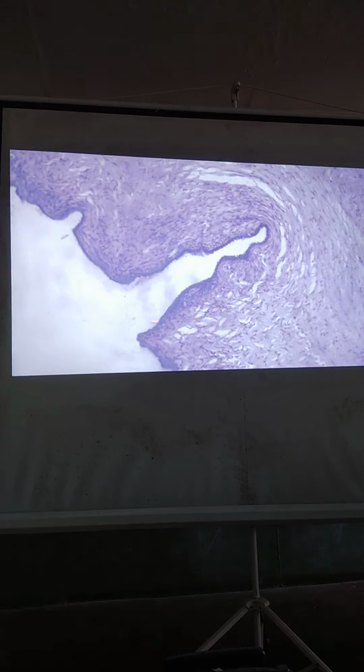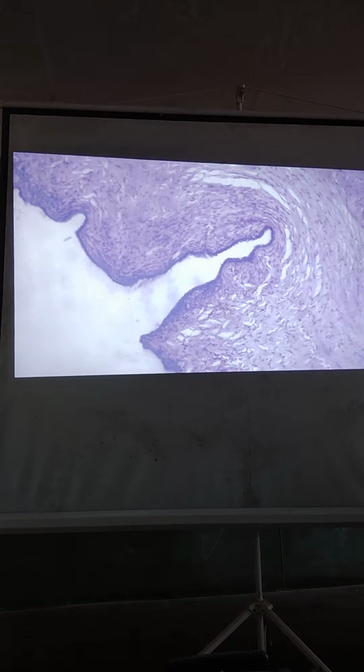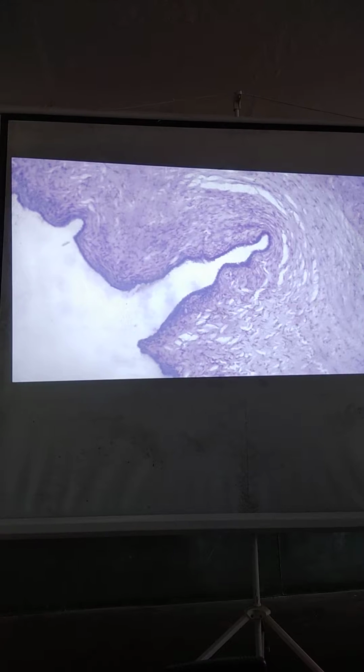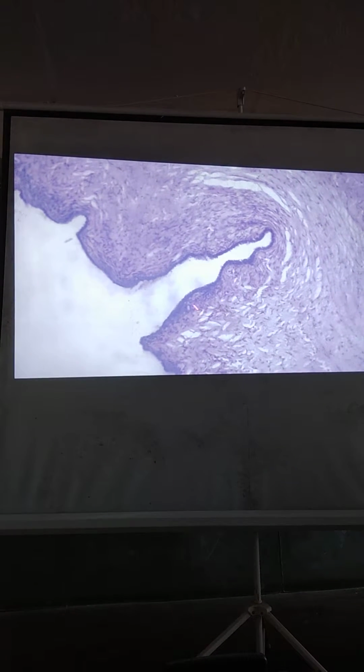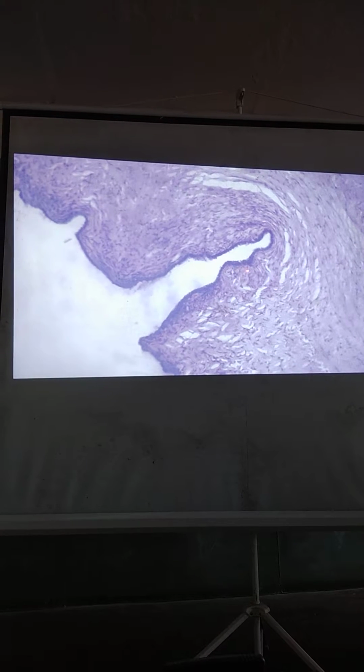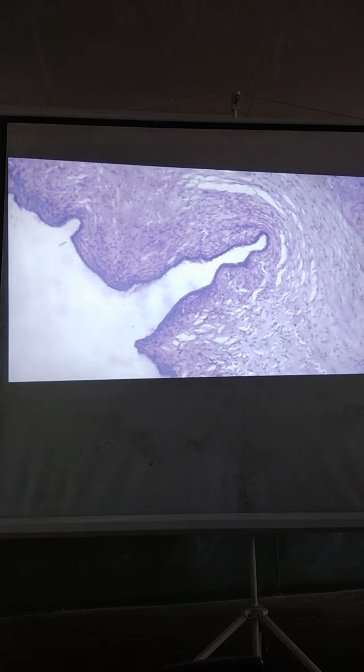Now, to know if it is benign or malignant, you have to know the features of a normal epithelia and an abnormal one at the cellular level and at the tissue level. At the level of the cells, malignant cells usually have enlargement of the nucleus.